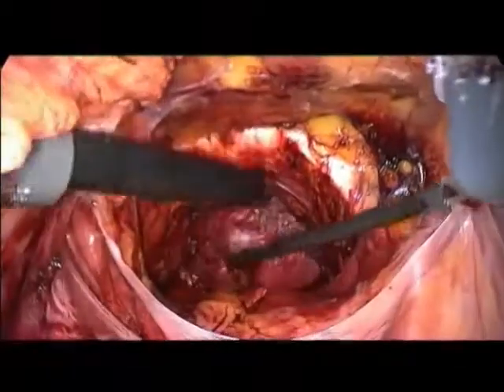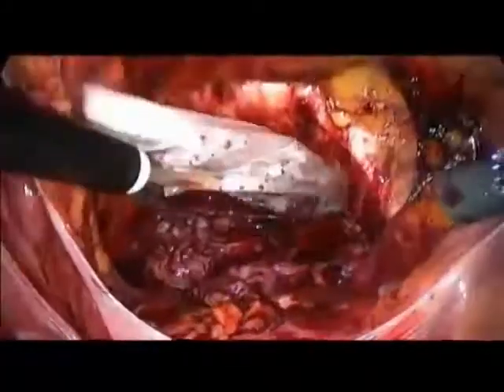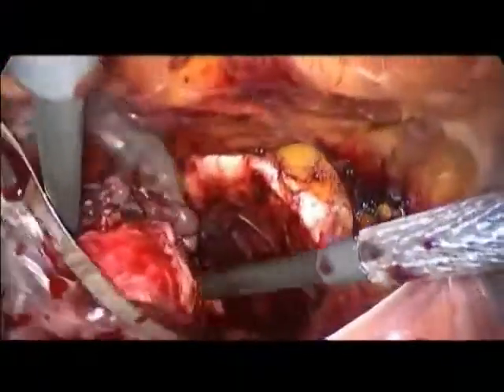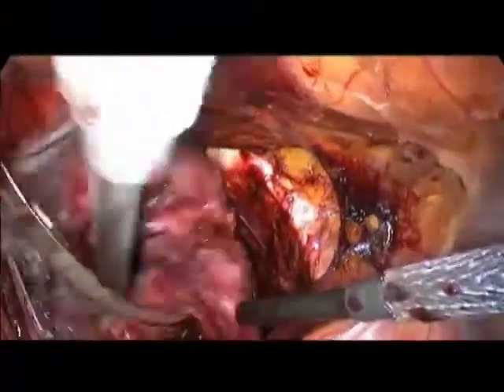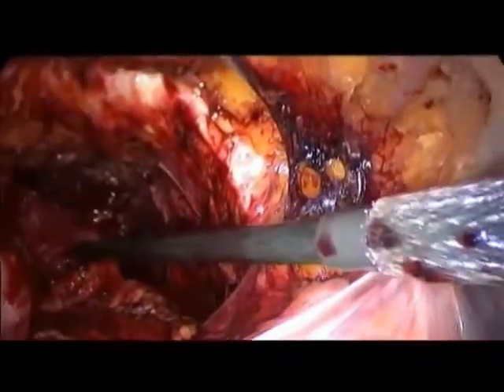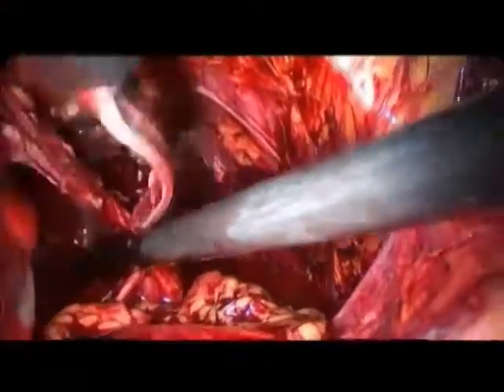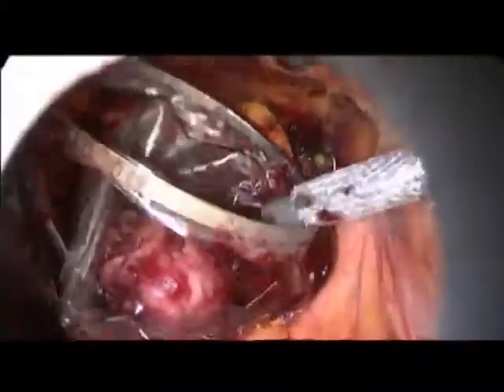So this is butterfly hunting. Something remaining behind, as you said. It's at the level of the seminals, I think. The base. It's okay. It was a small remnant of the Denonvilliers. No problem.